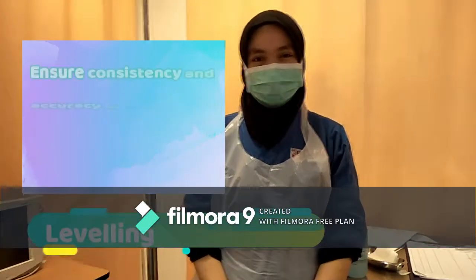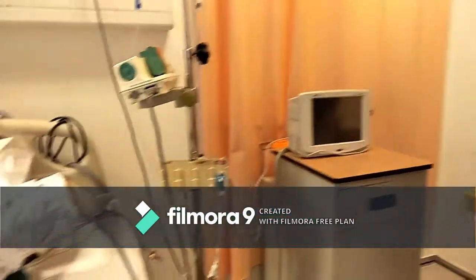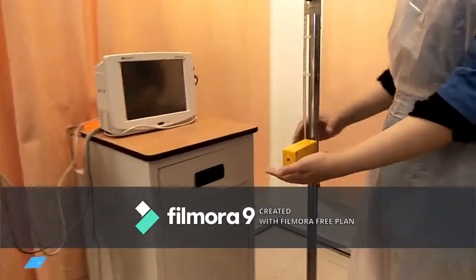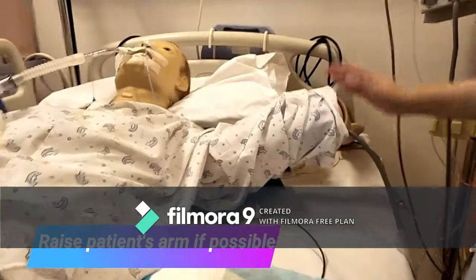The purpose of leveling and zeroing is to ensure consistency and accuracy of the arterial blood pressure monitoring. To perform an arterial line leveling procedure, we will need a pointing laser. First, ensure the patient is lying flat on the bed and, if possible, ask the patient to raise the arm.